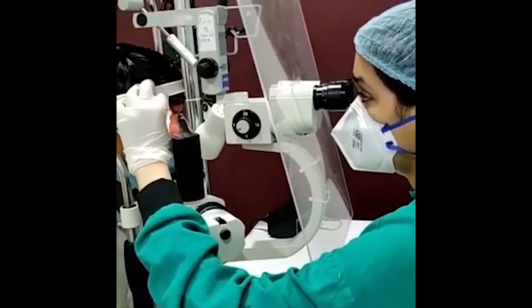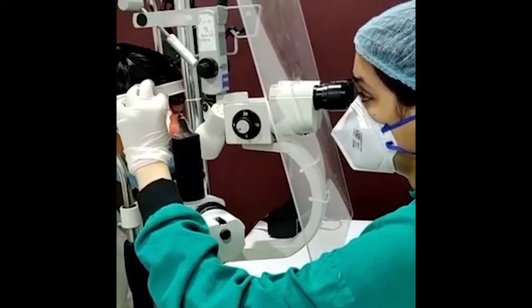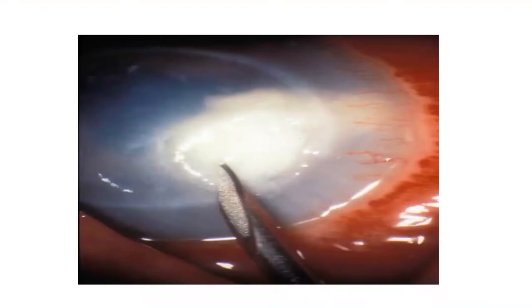This is the OPDI demonstration video of the corneal scraping procedure. The video is made with the consent of the patient. After explaining the procedure to the patient, an installation of two drops of 0.5% paracaine, which is the topical anesthetic drop, is given and corneal scraping is done on the slit lamp under all aseptic precautions. Gentle corneal scraping is done using the sharp end of a number 15 blade from the base and edge of the ulcer.